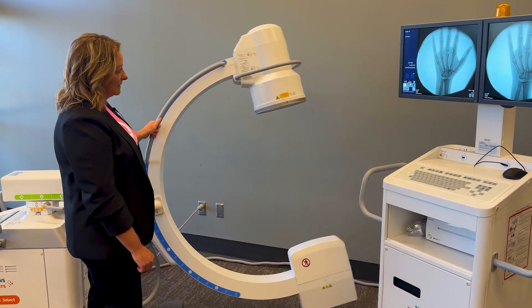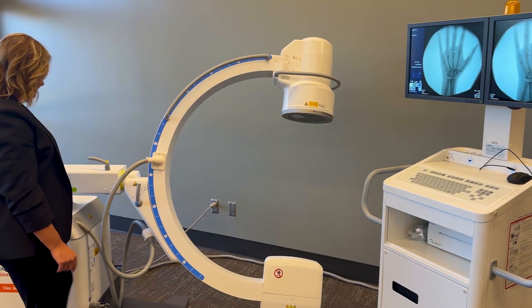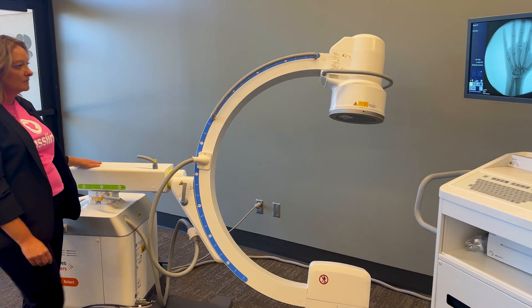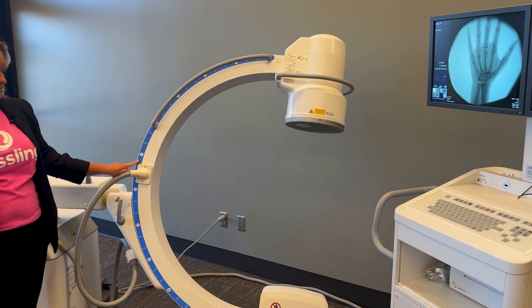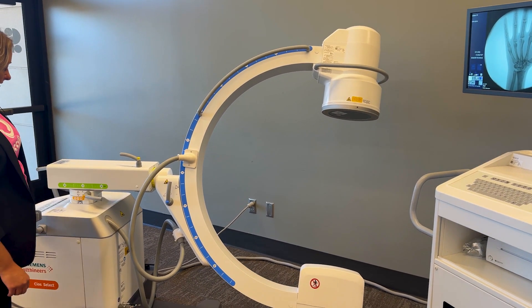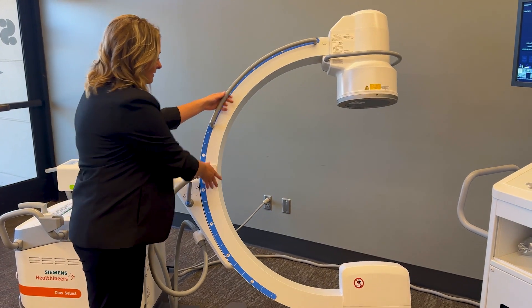It is counterbalanced, so you can have multiple locks unlocked at the same time without having to re-lock them. They are unique Siemens color-coded locks that are easily maneuverable.